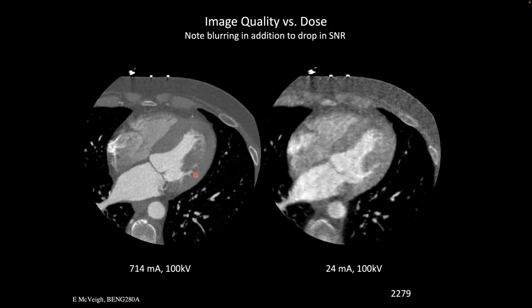Okay. And so with that amount of X-rays, you get a picture that looks like this. Interestingly, this image is from a sequence through the heart, and that sequence lasted one R to R interval of a heartbeat, so from one QRS to the next QRS. And then as it came up to the second heartbeat, the scanner ramps down the mA on a continuous ramp as it's shutting off. You still have X-rays coming out, and so you can make a picture inside that ramp, right?